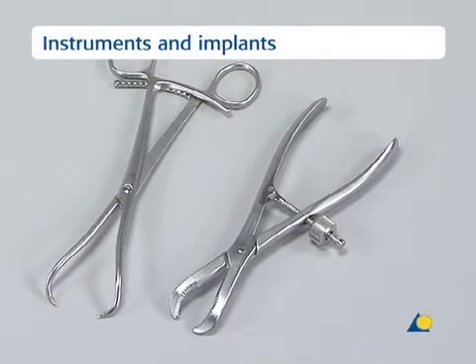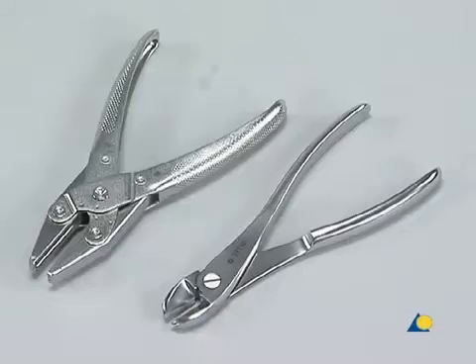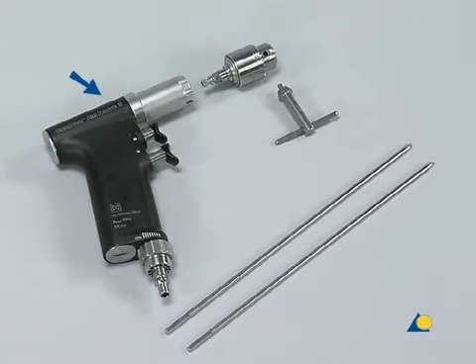The instruments and implants needed are, from left to right: the large pointed reduction forceps, the toothed reduction forceps, the wire tightener with handle and two pegs, the flat-nosed parallel pliers, the small wire cutter, and four 1.25 mm cerclage wires with eye. Also needed are the compact air drive or a similar device, the chuck and key, and two 4.5 mm diameter Steinmann pins used for the intramedullary pinning.